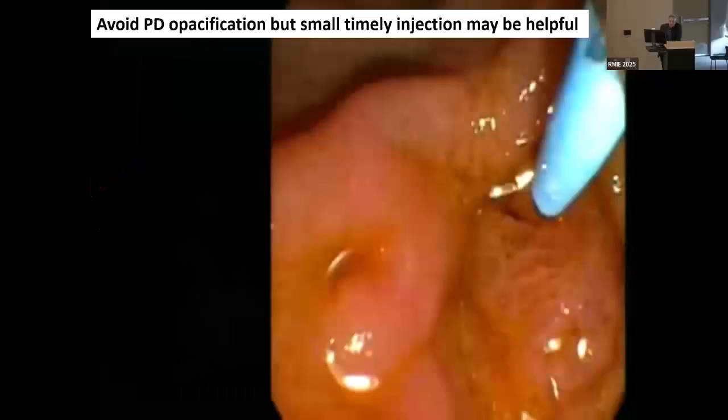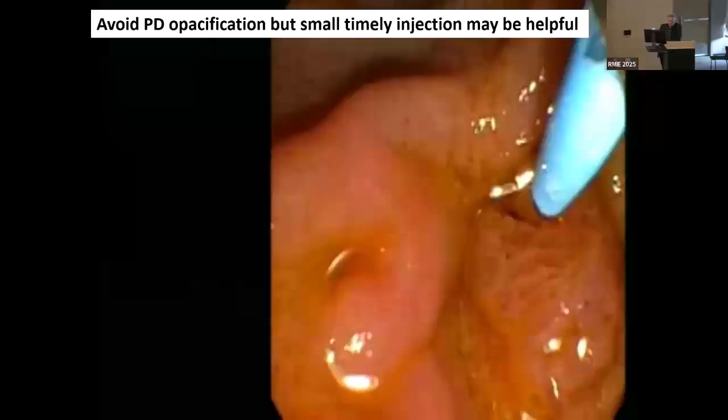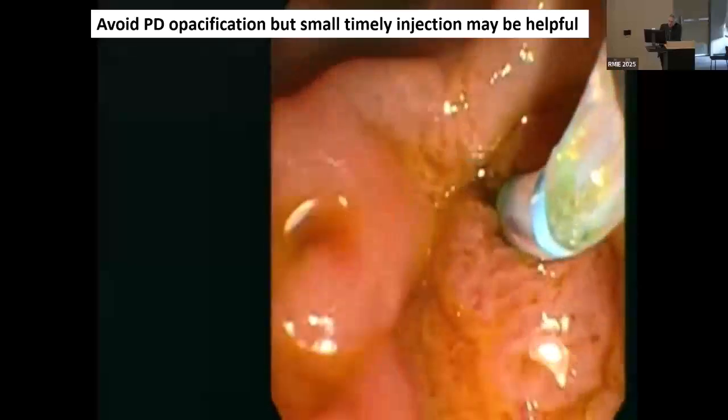Now, as I mentioned, you should avoid pancreatic opacification. When you look at the studies, it used to be, I don't know if you remember yesterday, you saw there was a picture of an ERCP where you could see the tertiary, quaternary pancreatic ductules and so on. That's the way that pancreatic duct opacification was done. It's obviously not what we do. I think a lot of the data came from aggressive, repeated, quite significant pancreatic duct opacification. A little bit may not be a bad thing, but obviously we discourage it as a rule.